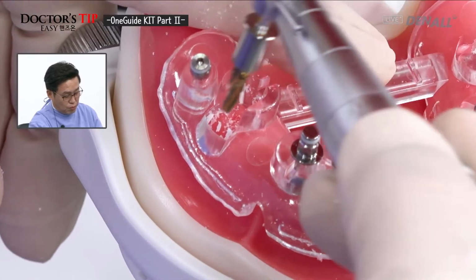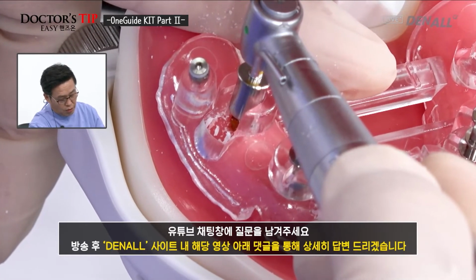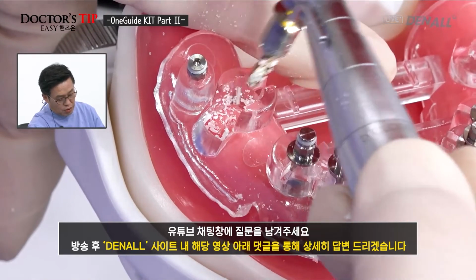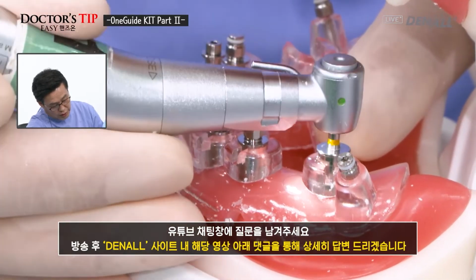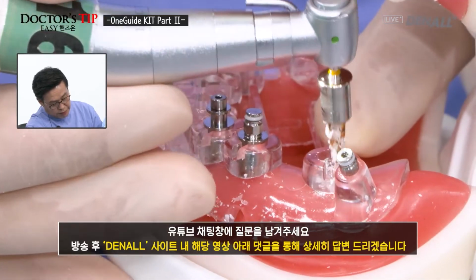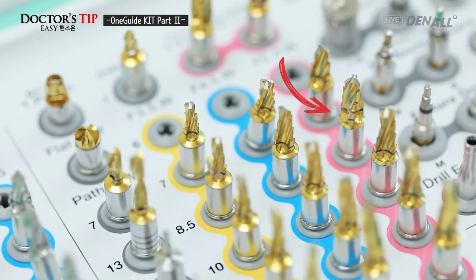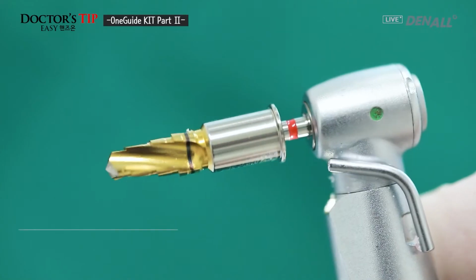On 46, double contact concept is going to be used, and it's in contact with the bone in the bottom, and full length drilling is done. On number 36, full length drilling is going to be done, up and down. Next, 5.0 by 8.5 drill is chosen, and final drilling is being done.